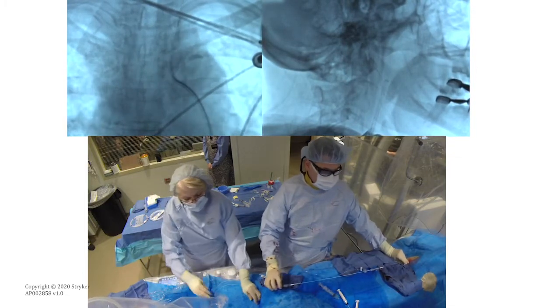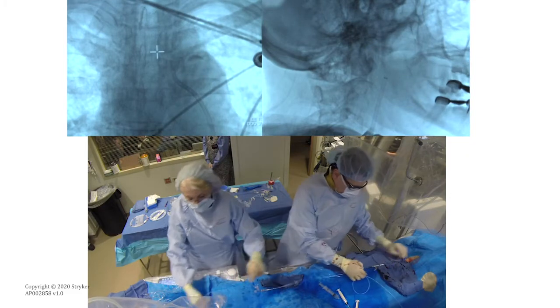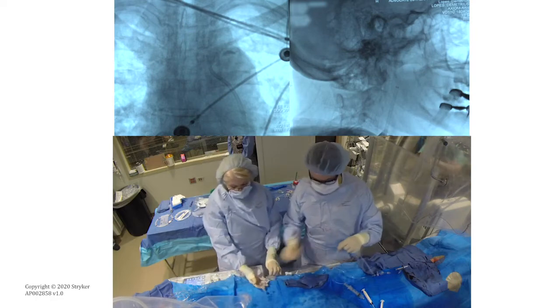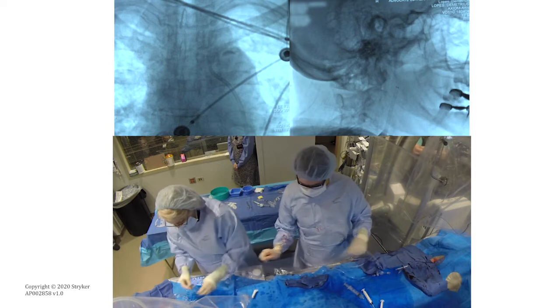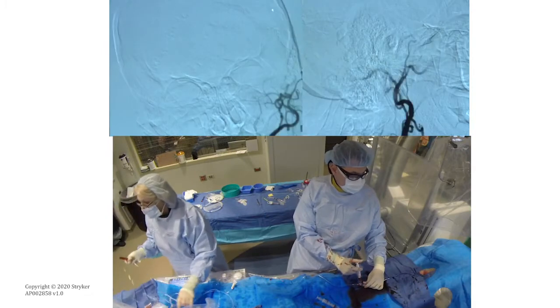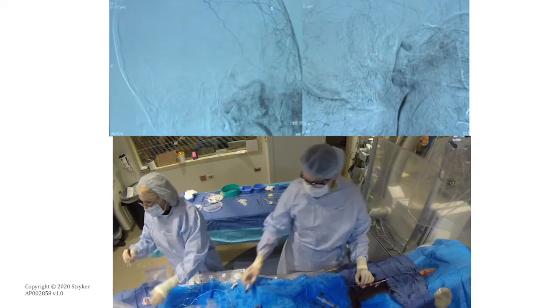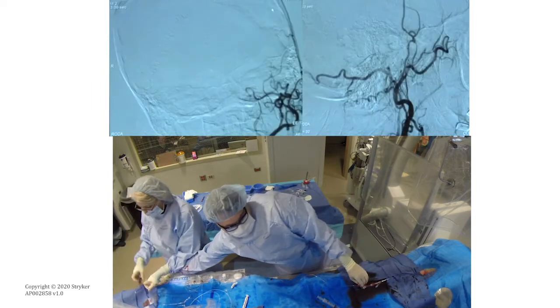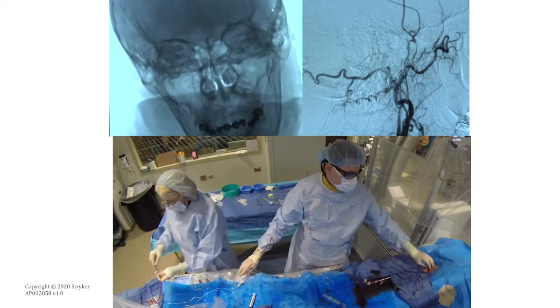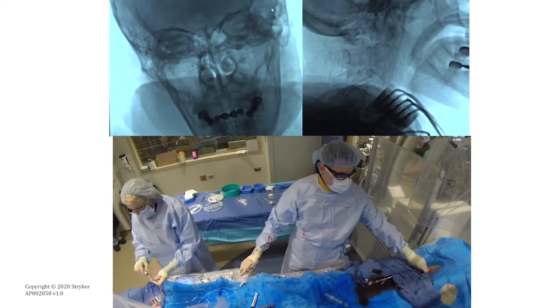After getting relatively fast access to the left common carotid artery, we park the FlowGate 2 in the common carotid artery and obtain initial imaging of the anatomy prior to advancing into the internal carotid artery. The setup from here on will determine things. In this case there was a pretty significant compromise of circulation, but there is flow through the bifurcation, so it seems to be mainly an intracranial problem. You can assess how the anatomy of the cavernous carotid artery is, and that is what helps us decide what type of intermediate catheter to use.